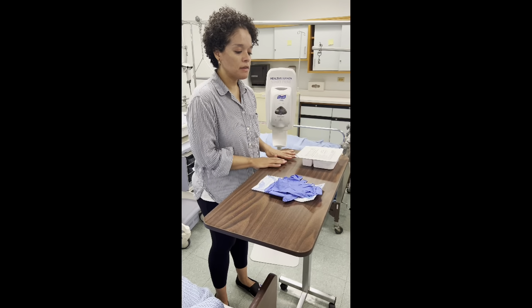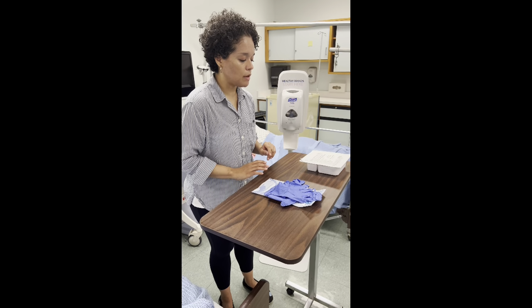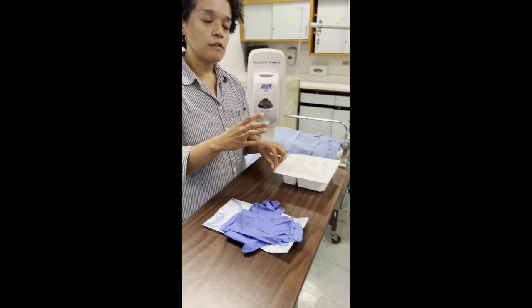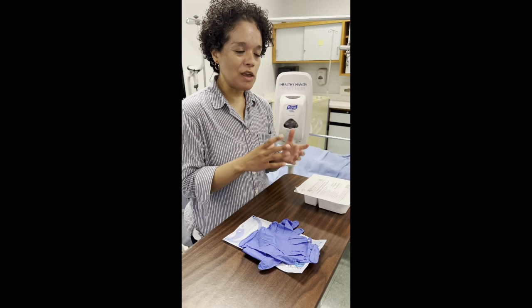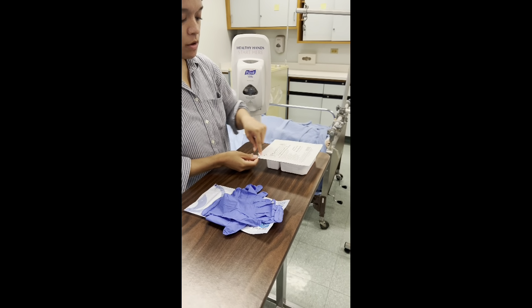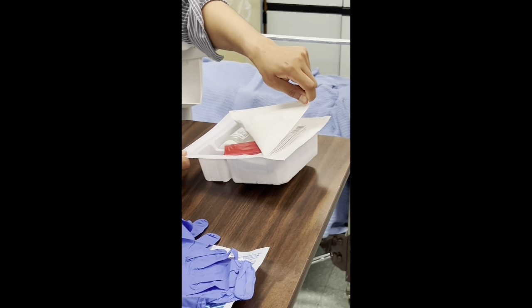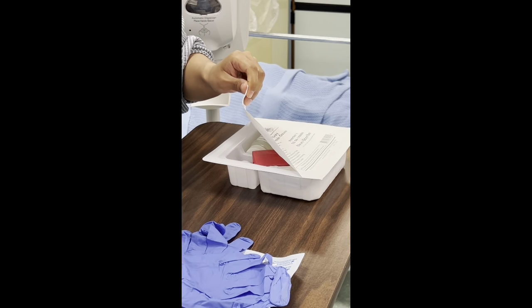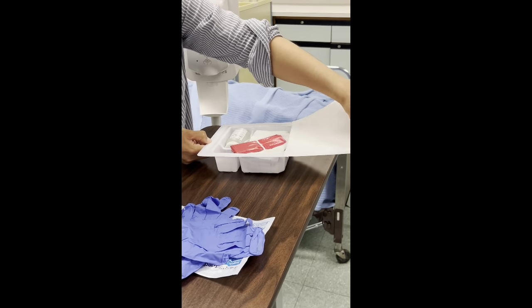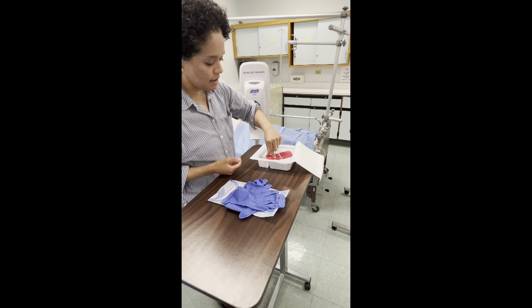Okay, so I have my supplies and my gloves on the table. So I'm going to take out the disposable bag in which we'll be placing the old dressing and any other trash. So I'm just going to, over here, just lift it away from my body. You want to make sure that the table itself is at waist level, right? I have here the bag, it's this one.